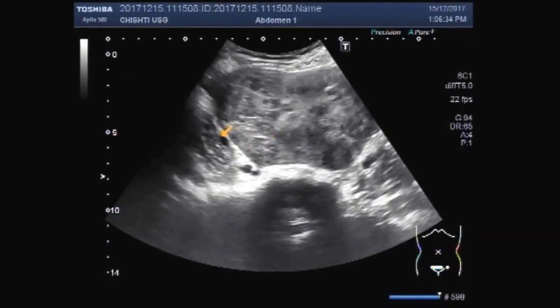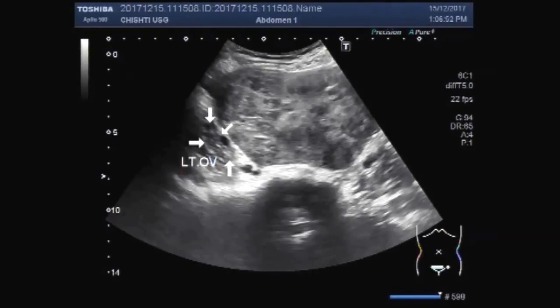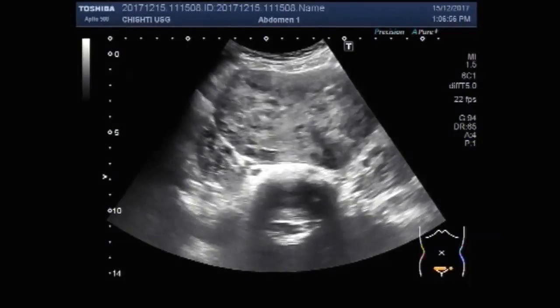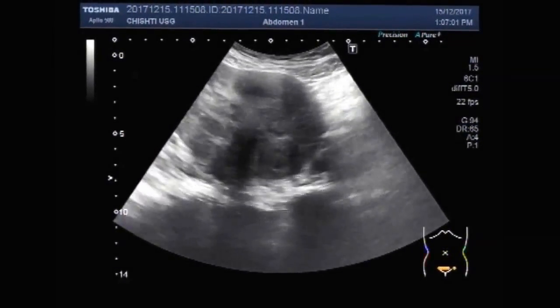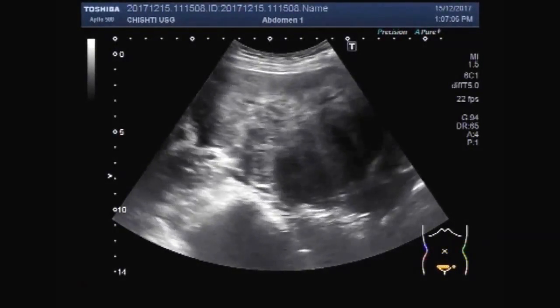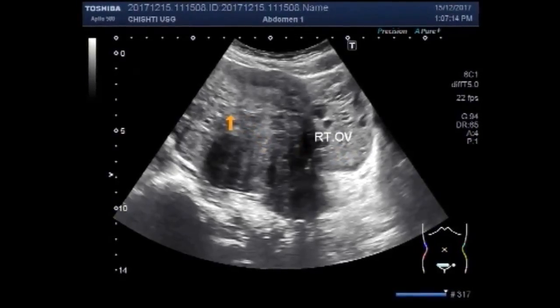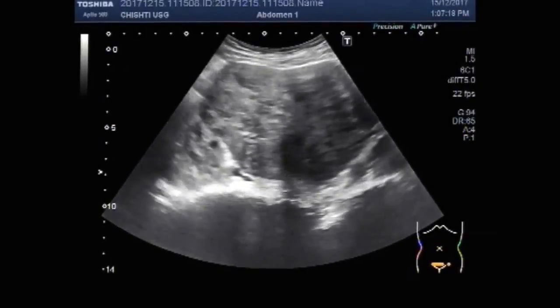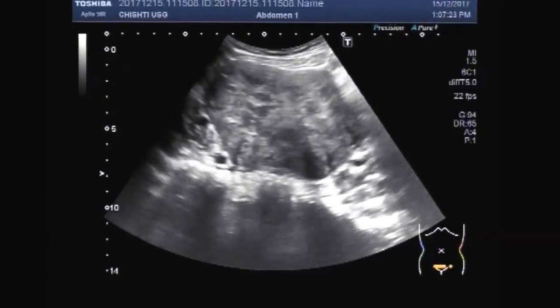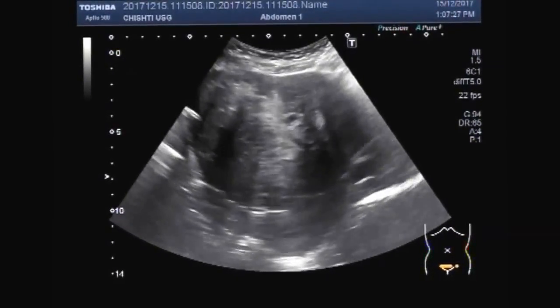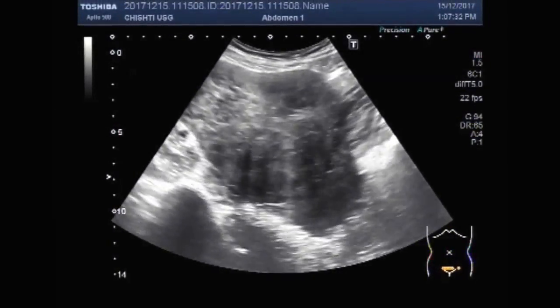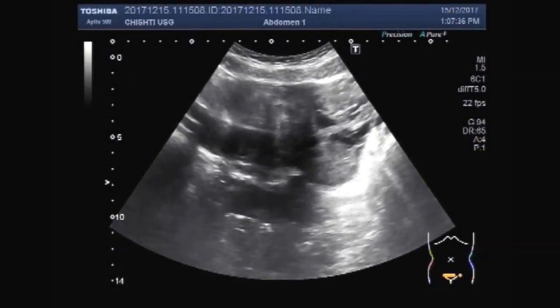And this one is the left ovary. In fact, the mass lies in between both ovaries, because both ovaries are visible and they are lying clearly outside the mass.